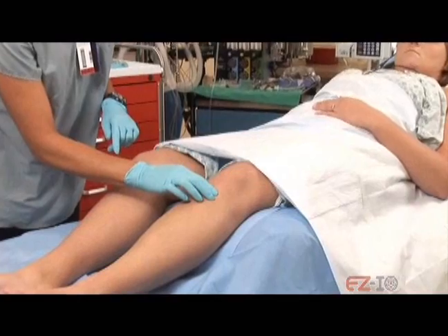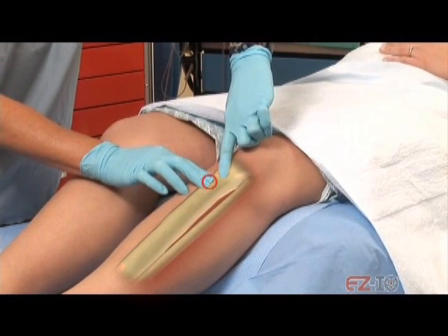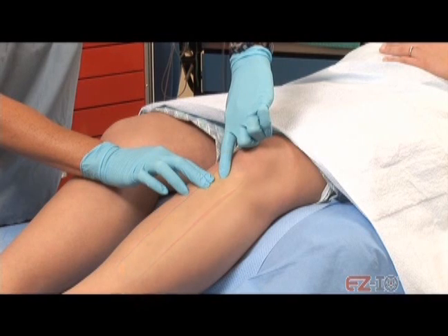The proximal tibia insertion site is approximately 2 centimeters below the patella and approximately 2 centimeters medial to the tibial tuberosity, depending on patient anatomy. The insertion sites for pediatric patients are the same as those for adults. In small children, generally under the age of 2, the tibial tuberosity may be difficult or impossible to locate. If the tibial tuberosity cannot be palpated, locate the distal aspect of the patella. Move approximately 2 centimeters distally, depending on patient anatomy, and then medial to the flat aspect of the tibia.